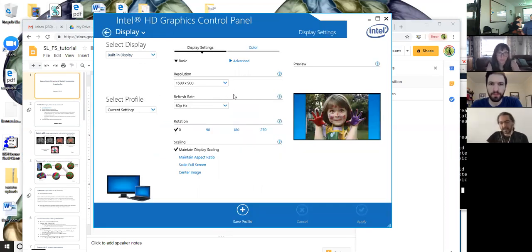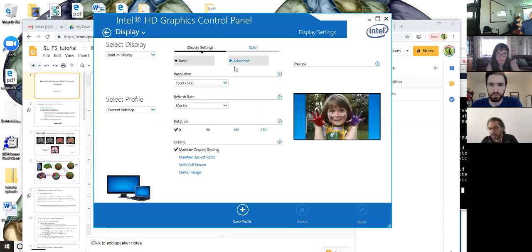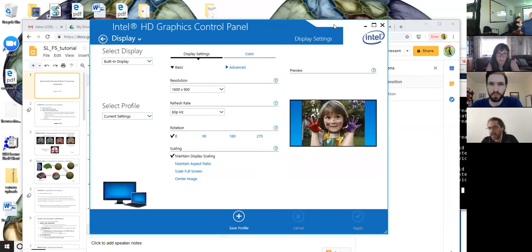Right. I mean, for the group level results, at least if you have the voxel level analysis and the suprathreshold clusters on those, you can also just read those clusters within those masks of voxels, basically. Read them using ROI analysis to basically count the number of suprathreshold voxels within each ROI. But that would just give you a number for each ROI. Is that what you want, or do you need to do that in a subject-specific manner? No, I think that would work.